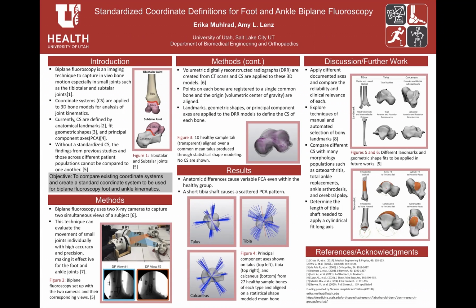After different frames of the fluoroscopy data are aligned with the DRR, a coordinate system is assigned to each bone. After a thorough literature review, it showed that many research studies that use biplane fluoro do not use the same coordinate systems to calculate bone kinematics in the foot and ankle. This makes it really difficult to compare findings between studies and across different populations. This study's objective is to compare different coordinate systems used in previous literature and determine and analyze the effectiveness and reliability of each. Finally, we want to propose a single standardized coordinate system for foot and ankle biplane fluoroscopy kinematics.